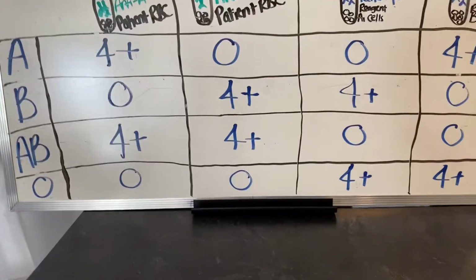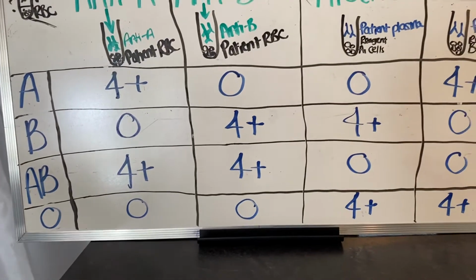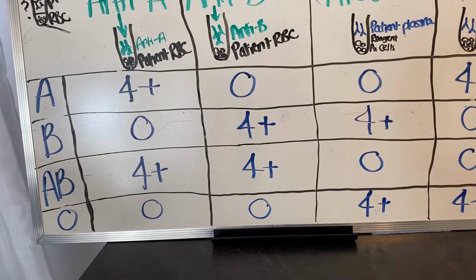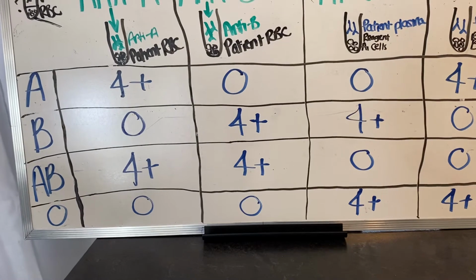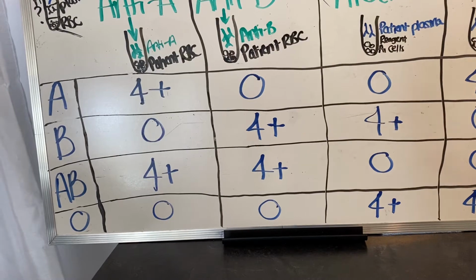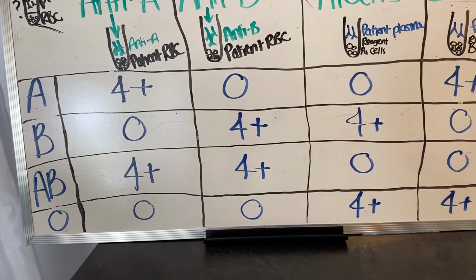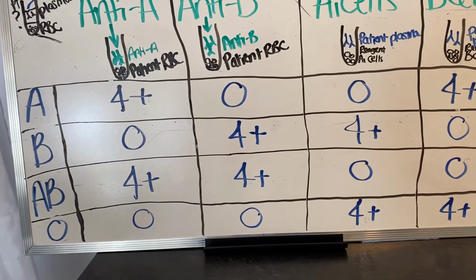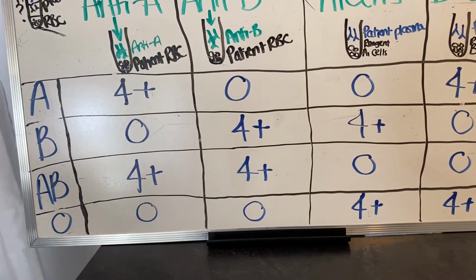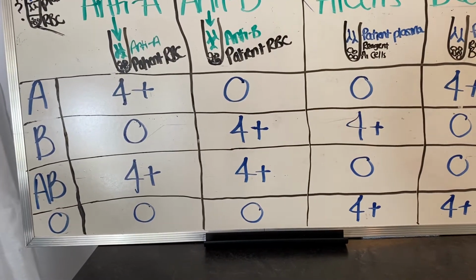We don't have to take anti-H and test every single group O person that comes up, because 99.999% of people have that H antigen, even if they're group O. They'll just be coded with H antigen. You can't just assume that they're all going to be Bombay, because there's very, very few people in the world who are actually Bombay. So few that it's negligible. So we're not going to take an anti-H antiserum and confirm all of our group O's and make sure that they have the H antigen. That's not something we do.